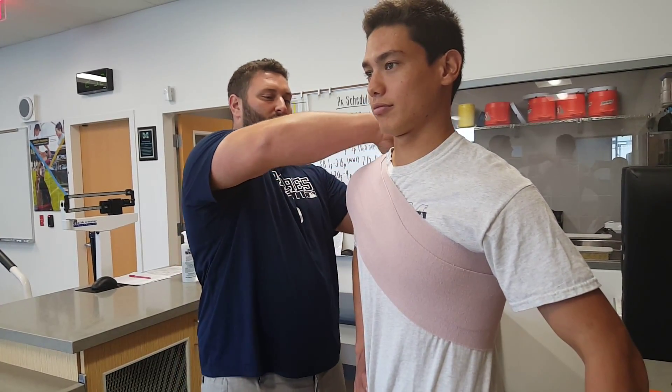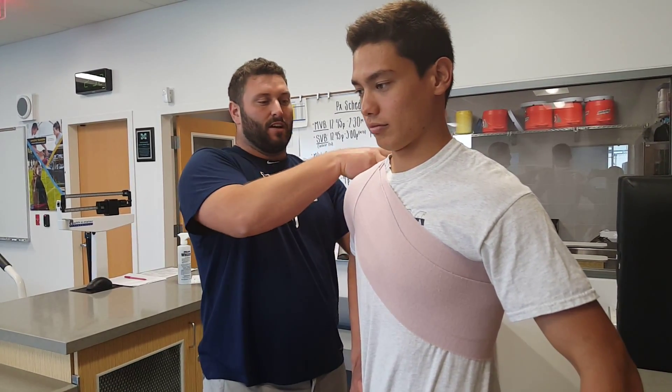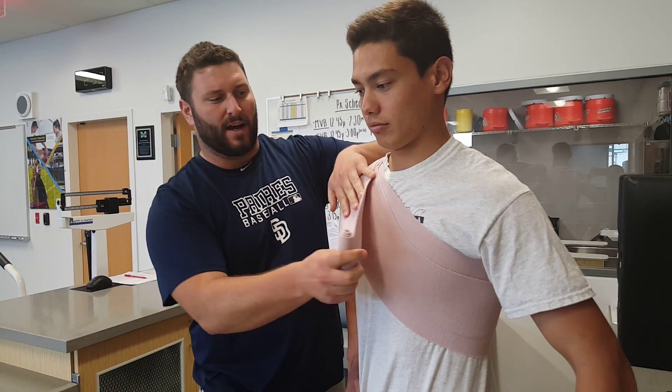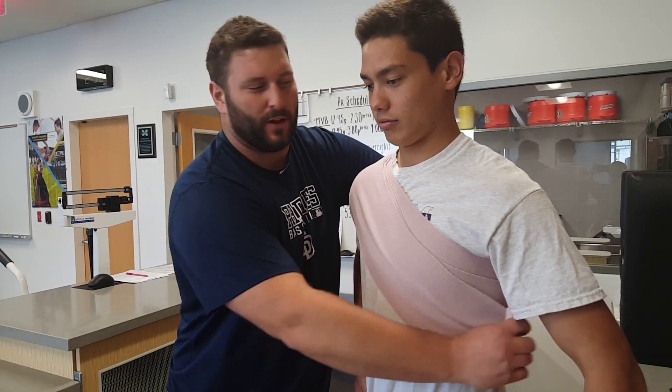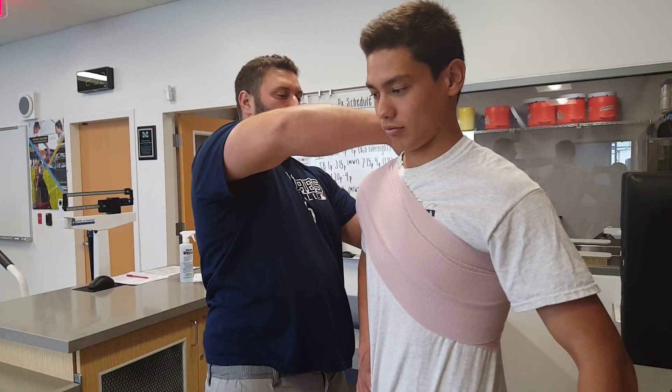This wrap is going to be used for sport. You can use this so that the athlete can participate in sport if it doesn't involve excessive overhead movements like basketball or volleyball. So if he were to be playing something like soccer, he would be able to use this wrap to help keep that shoulder stable.